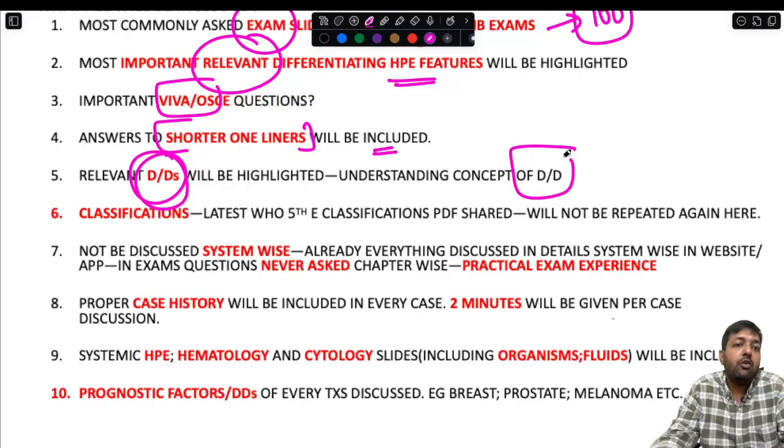So what we will do is, we are going to discuss the differential diagnosis for some relevant slides only. Okay, that is very commonly asked in the exam. Okay, so this is the concept of DDs.